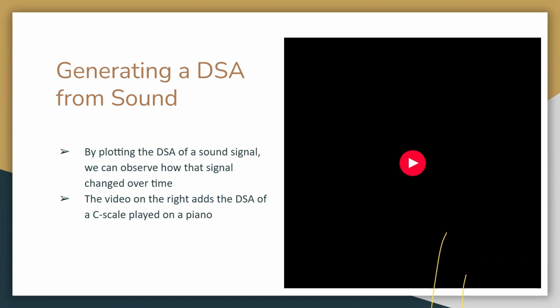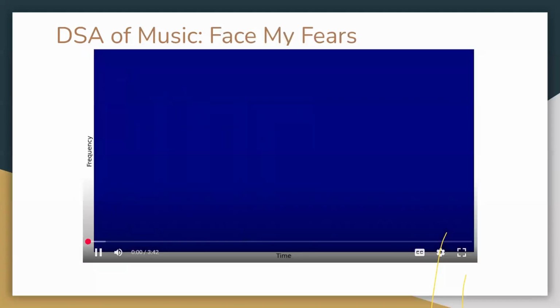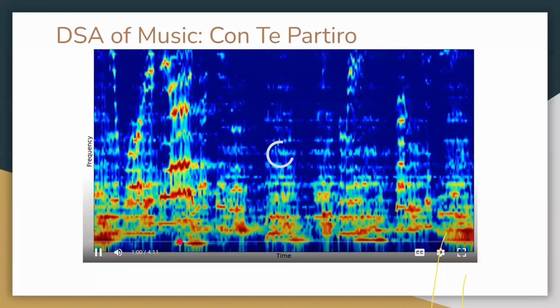That general trend in change over time is probably the most useful information to operators of the machines. You want to say, wow, the spectral edge frequency is going up a lot, I wonder what's going on with my patient. But every patient is going to have a different baseline, so the changes and trends are probably the most useful. I'm going to skip; I have several songs, like 60-second values.